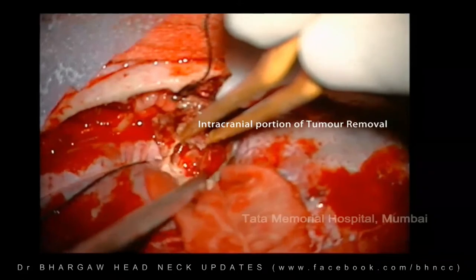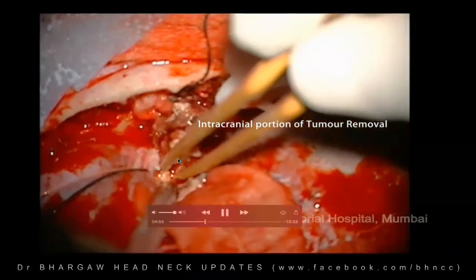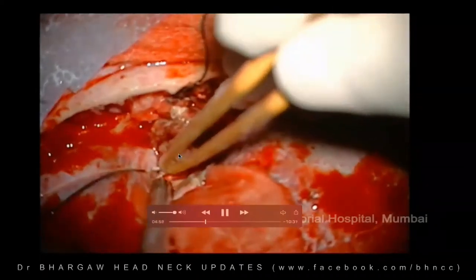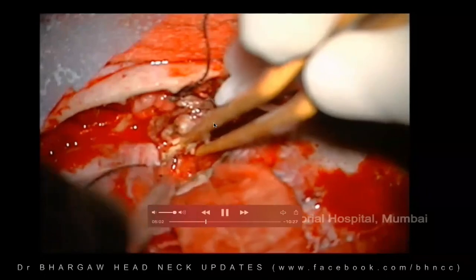There you see, once that is suctioned out, you see the normal white parenchyma that is there. So that's exactly the way the neurosurgeons function. They just do the suctioning and then just get it out, bipolar, suction it out.